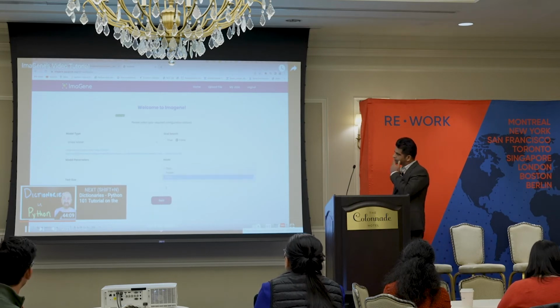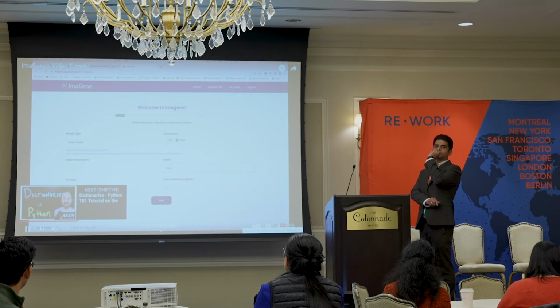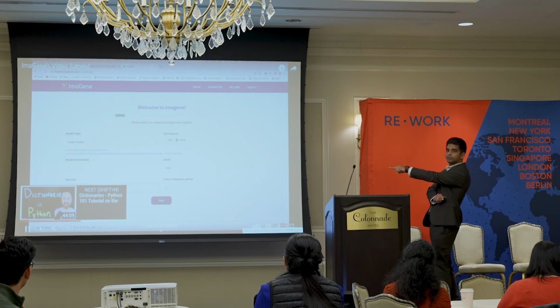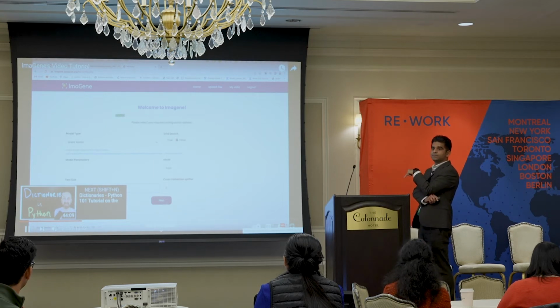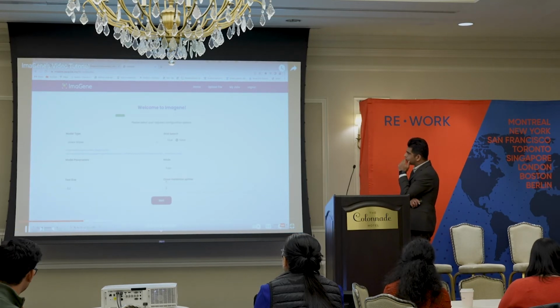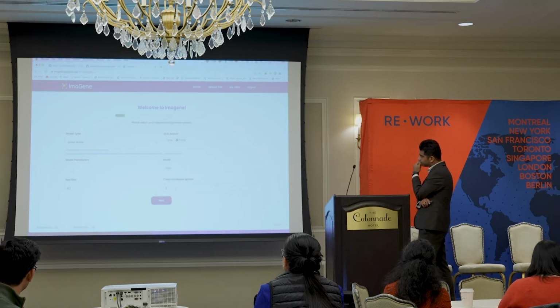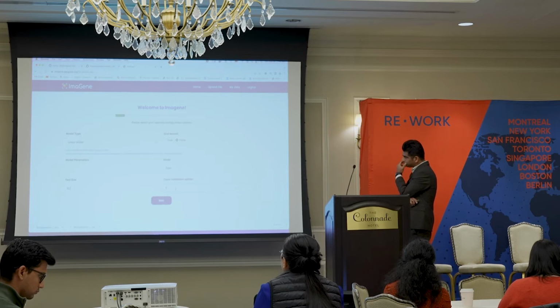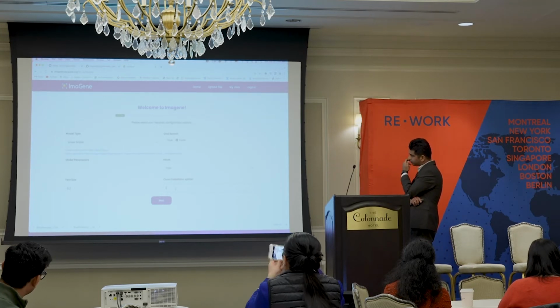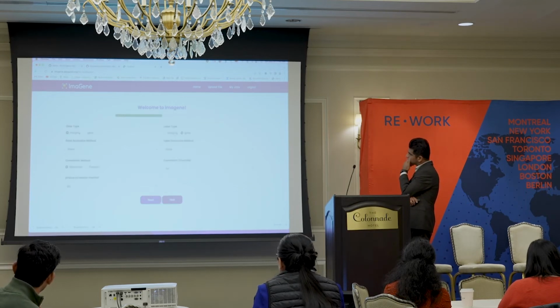And here in the mode, you can select between different modes: train, predict, validate. We'll go with the training. Here you can select your test size. So 0.2 indicates out of the total data set, 20% of the data would be used for test and the remaining would be used for training. This is a k-fold cross-validation splitter parameter that you could indicate to cross-validate the trained data set within itself. Setting it to 2, we move further.